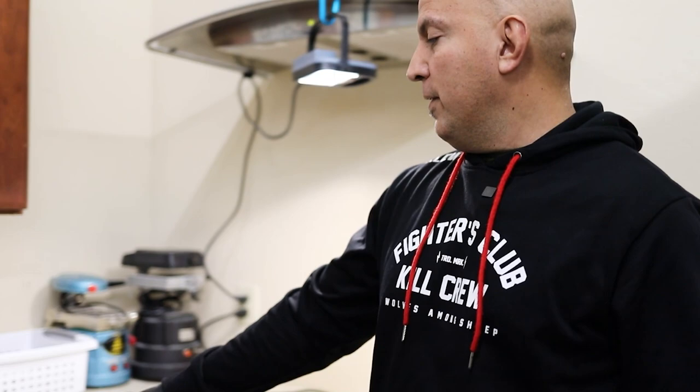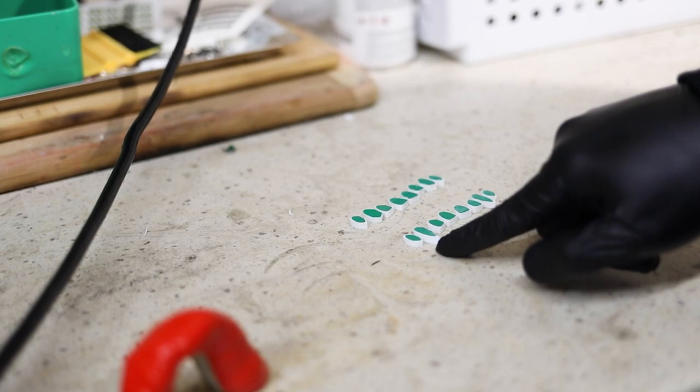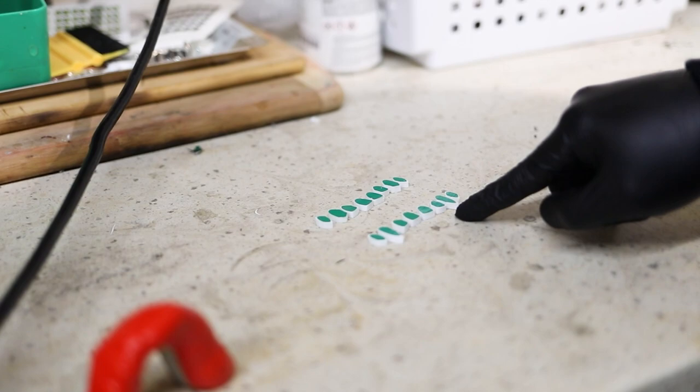So this is the setup of the teeth. You have the two front teeth, the two teeth next to that, and then you have the fangs. And that's usually where we stop, but we're gonna put an additional set of teeth on each end. So on this first mouthguard, he wanted fangs, and on his second mouthguard, he just wanted regular looking teeth.